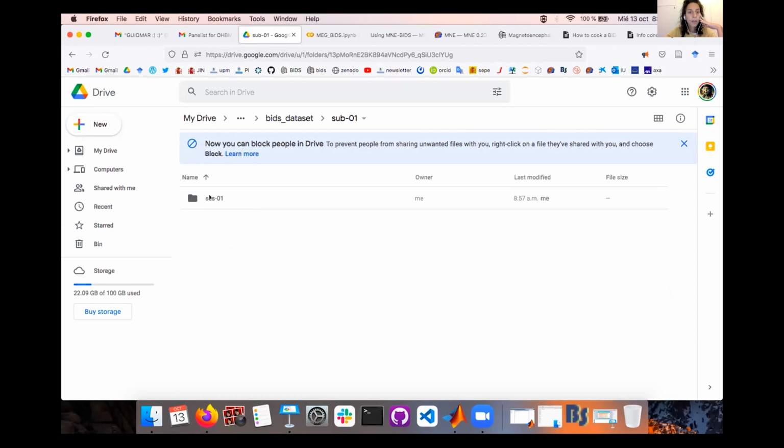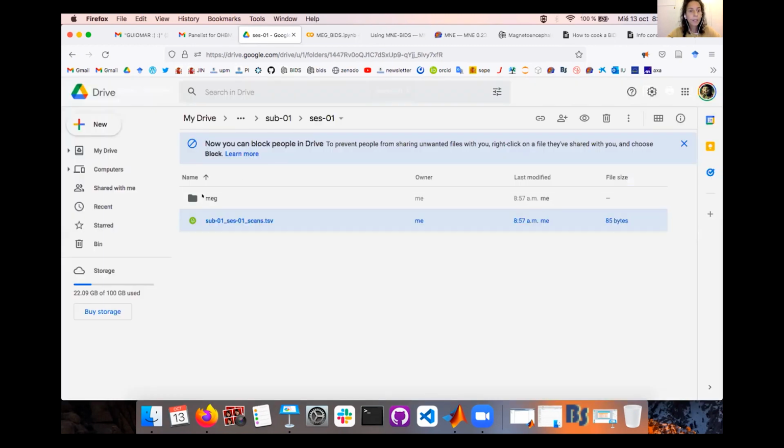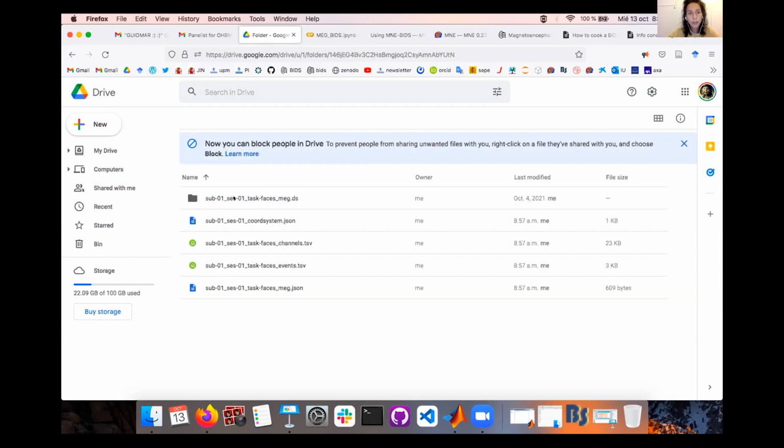So then we will have the first session, the scans file, with the session that is extracted from your file recording. Then there is the acquisition time that has to be input in this specific format, and inside the MEG folder you will have the session, the task for MEG, and the coordinate system JSON file, channels TSV, events TSV, and the sidecar MEG JSON file.